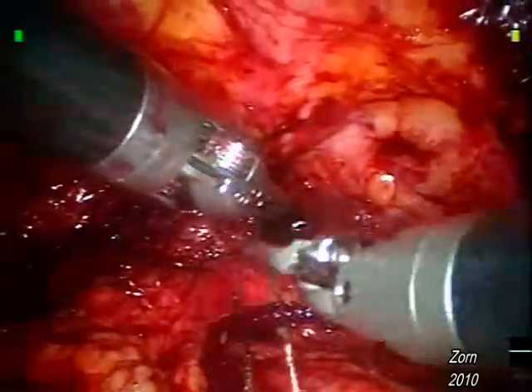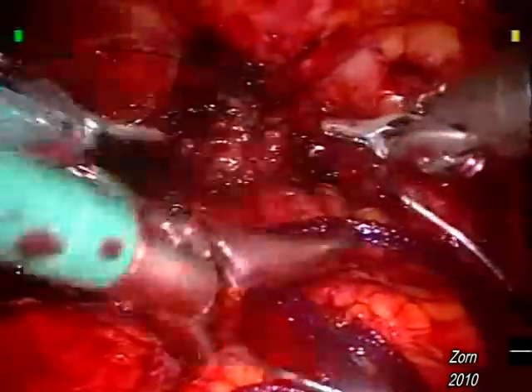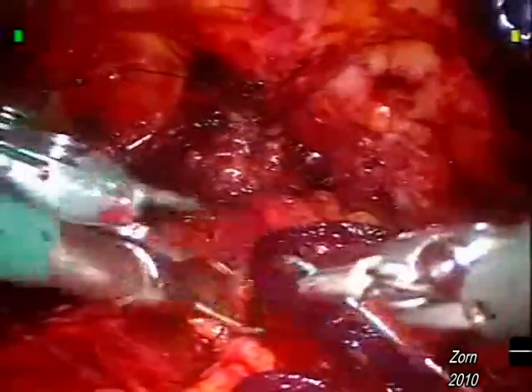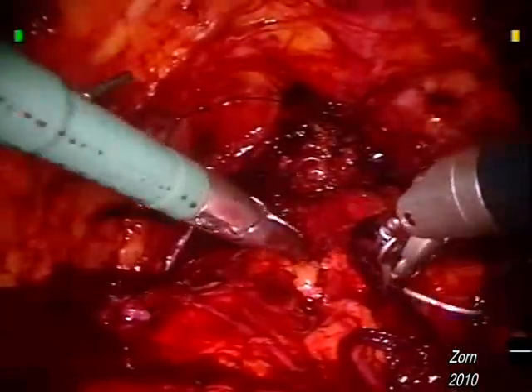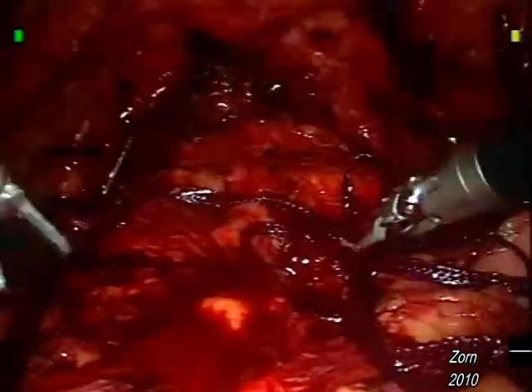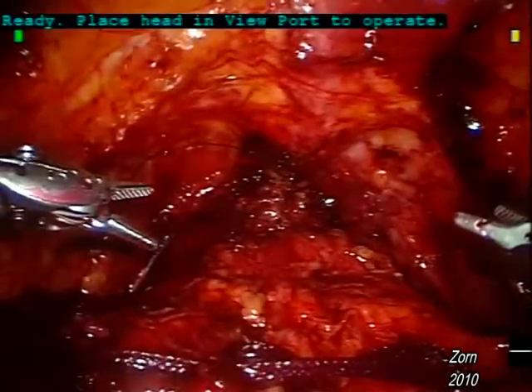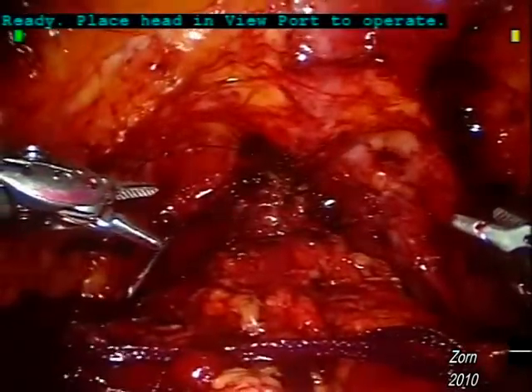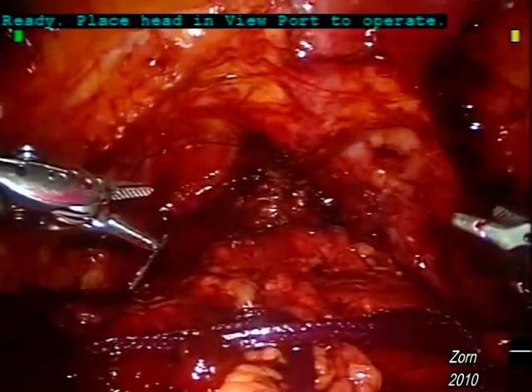Here we can simply snap the sutures and bring both needles outside the body. The assistant's Marilyn Grasper comes to individually remove the suture. The purple suture at the very bottom-left of the screen is that of the endocatch bag, with the specimen being the prostate and seminal vesicles, raised higher in the abdomen out of the surgical field during this part of the surgery. The assistant is now bringing in the final Foley catheter and inflating 10 cc's into the balloon of the catheter.